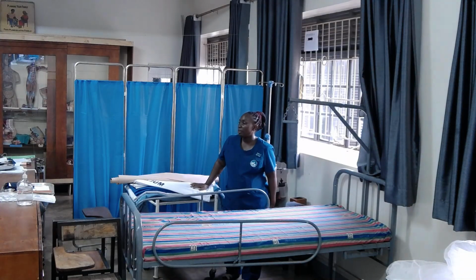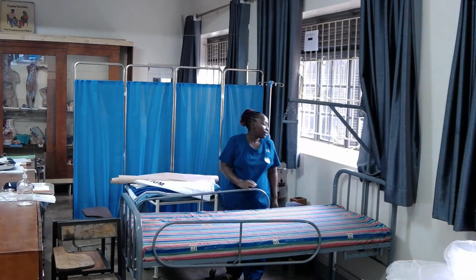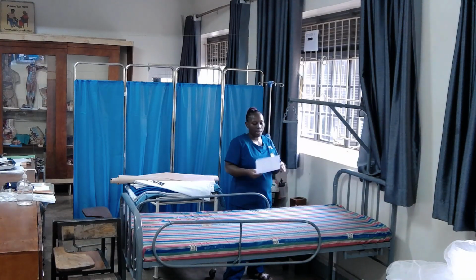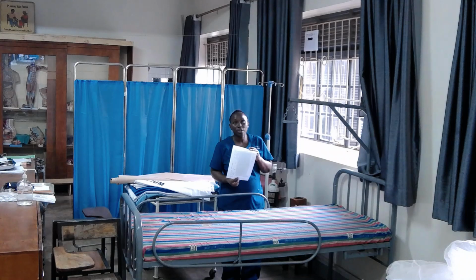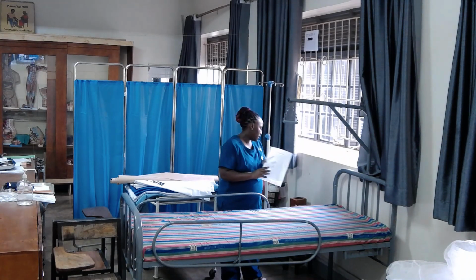However, we need requirements on other sides. We need a screen, which is right here. We need a head injury chart for monitoring the patient. These patients really require constant observation, and we chart everything on the head injury chart.